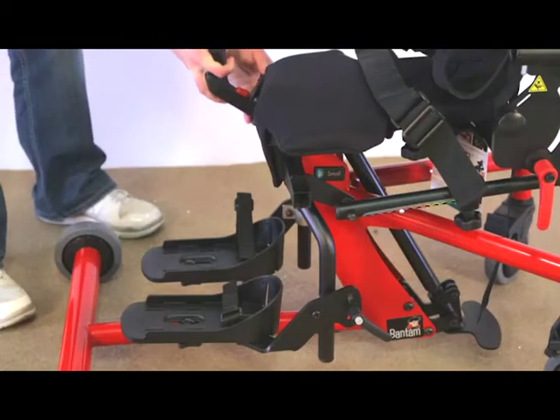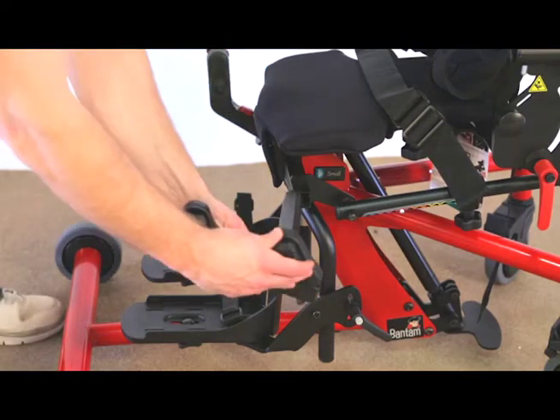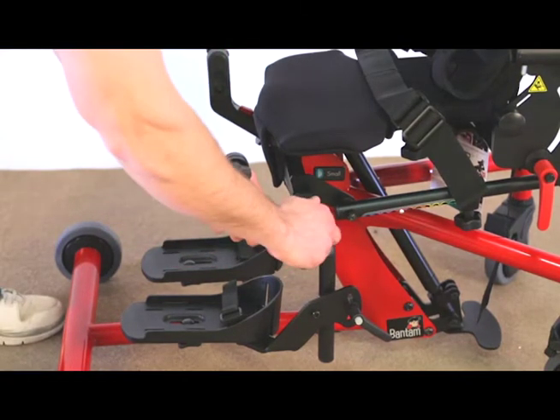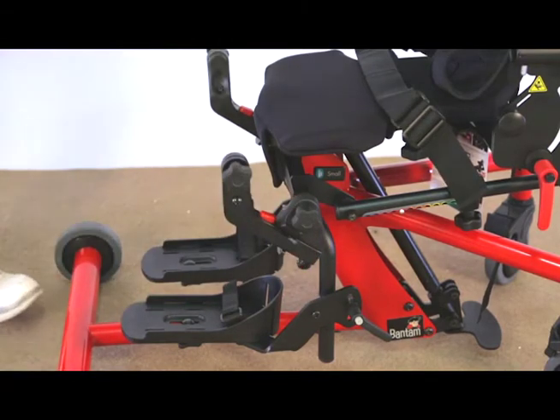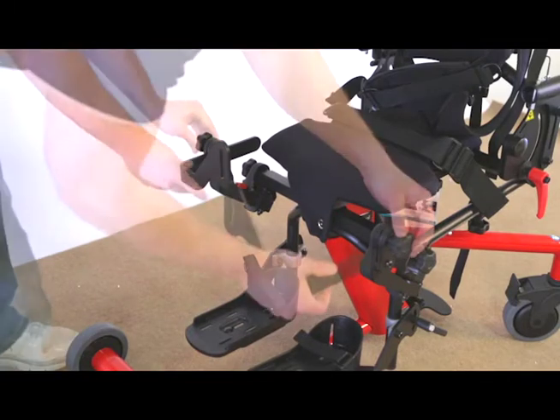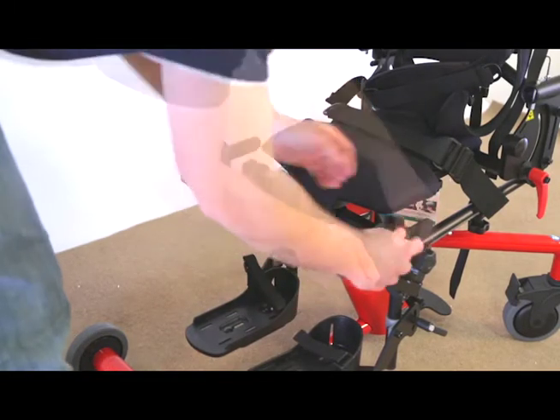Insert each knee bracket into the tubes onto the unit. Swing-away knees are shown. For standard knee, the clamp will be facing down. For standard knees, depress the spring button to allow the bracket to slide into place. Advance until the spring button locks into place. Tighten knob securely. For swing-away knees, tighten knob securely. Insert each knee pad bracket into the slot on the knee bracket. Tighten knob securely.